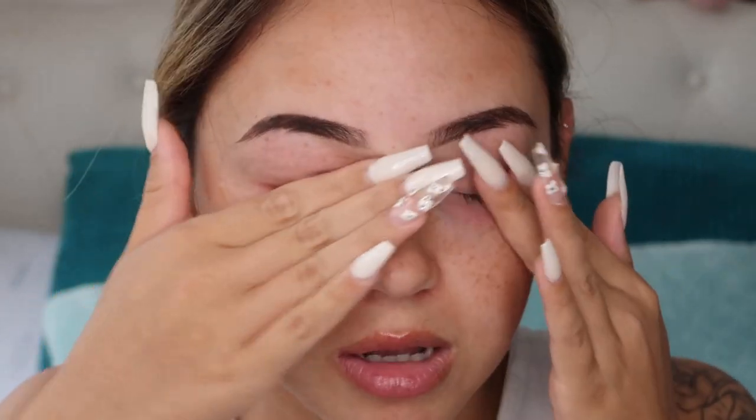I always put my contacts in before my makeup because the water comes out and I just rub my eye. Now I can see! That's how pretty much most people put their contacts in, but here is the trick.